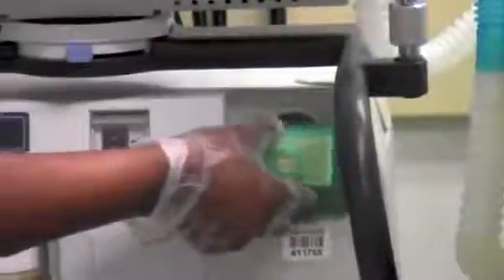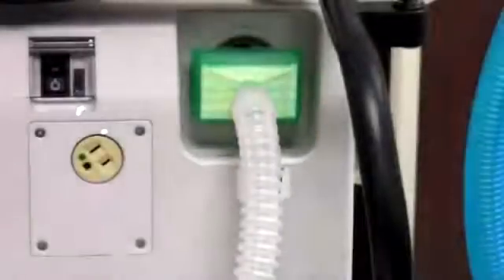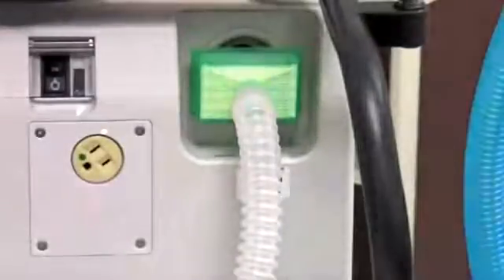You will now connect the inspiratory filter. To ensure proper installation, observe the flow direction markings on the filter.